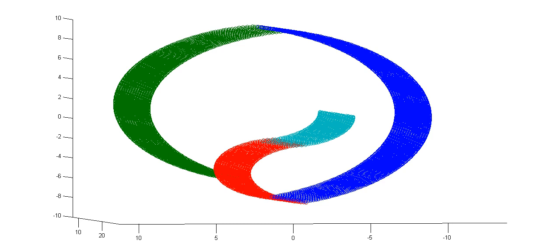And this subtractive method dates back to PET and other earlier forms of imaging, where you'd have people in two conditions and subtract them. So then you're just looking for voxels that have a difference between these two tasks. And then you can say, okay, this voxel shows a difference in these two tasks, so maybe this area is involved in the task of mental math, or whatever the task is. It's more or less active.